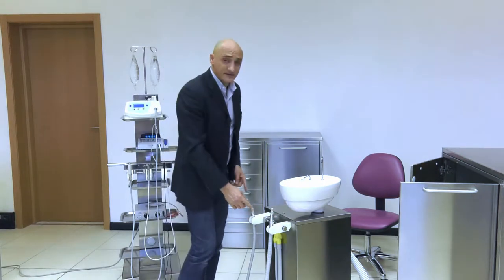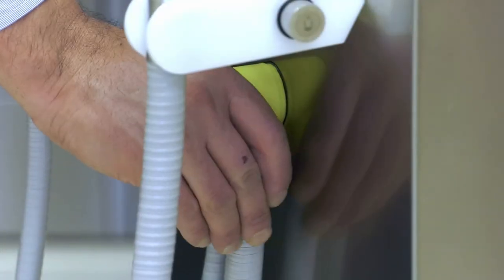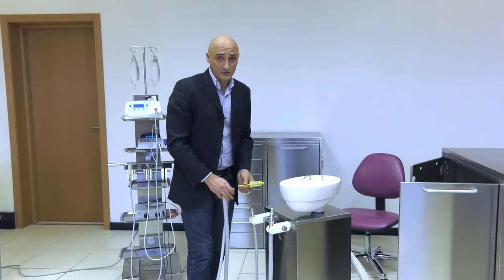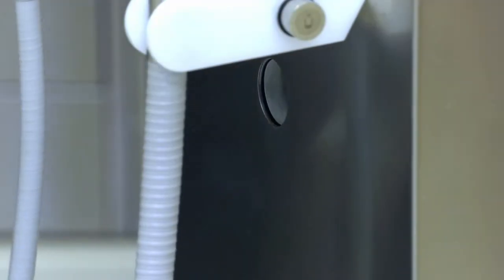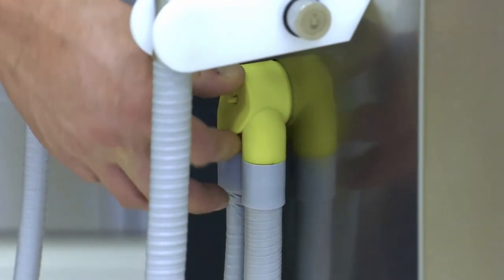Both cannulas converge into this yellow filter. The yellow filter is removable. Within it, there is another filter to keep any waste and dirt inside. Thus, I can easily and thoroughly wash it and fit it back into the unit.